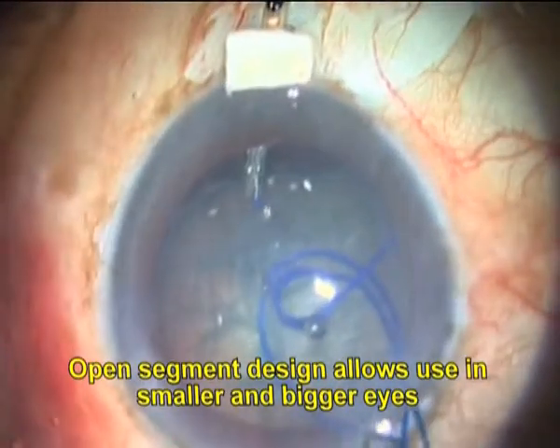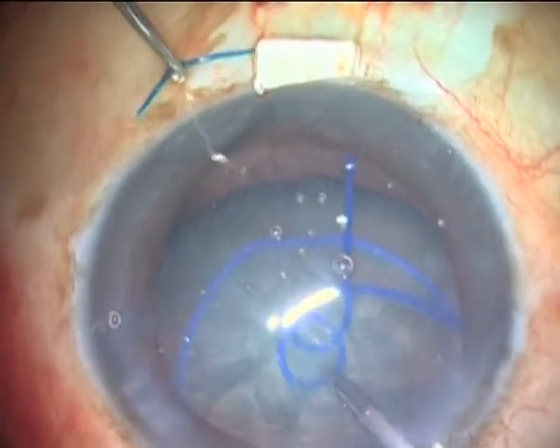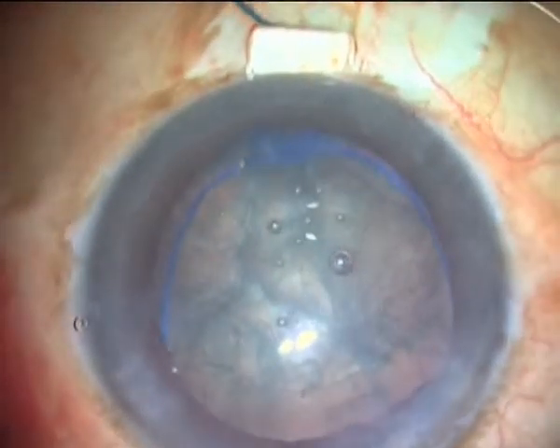The double scrolls of the device engage the capsulorexis rim in an atraumatic manner, similar to the manner in which the single scroll of the Malyugin ring engages the pupillary border for pupil expansion.